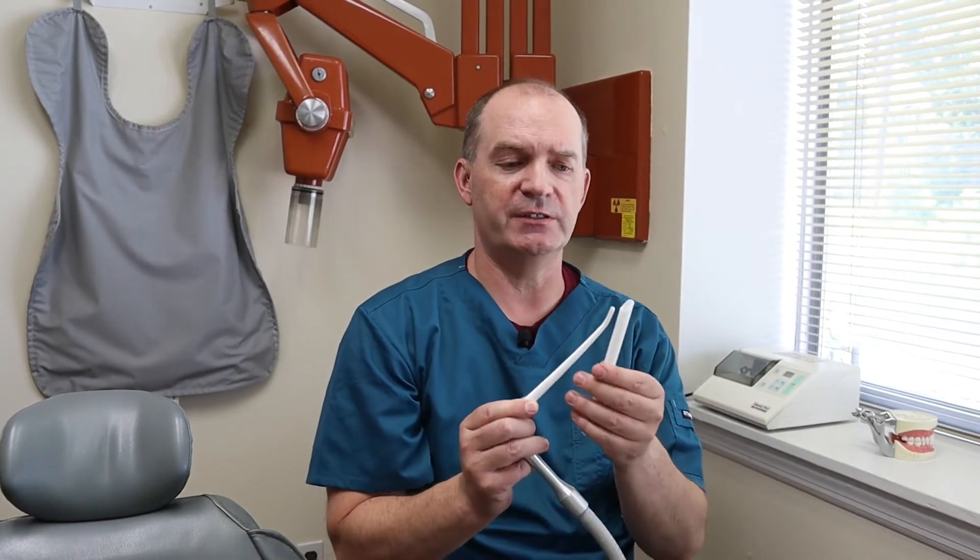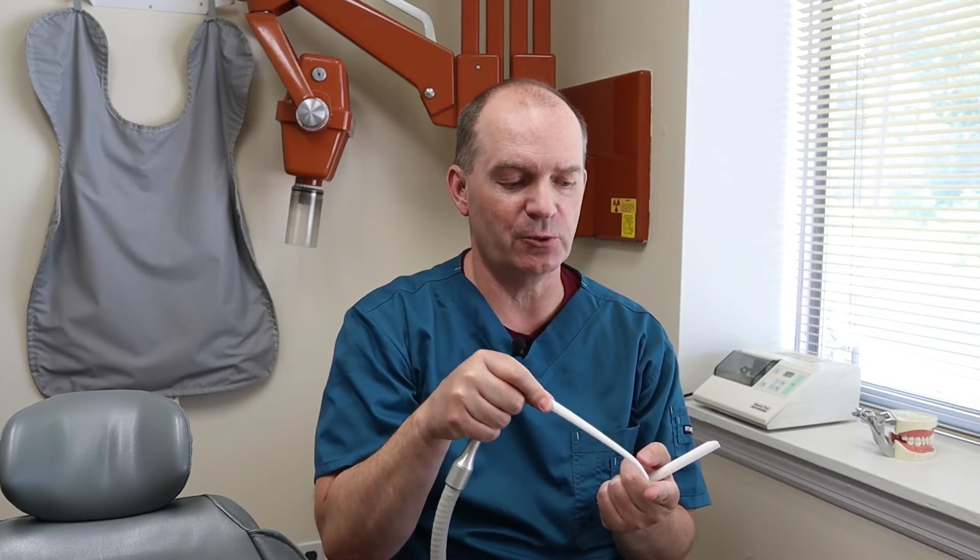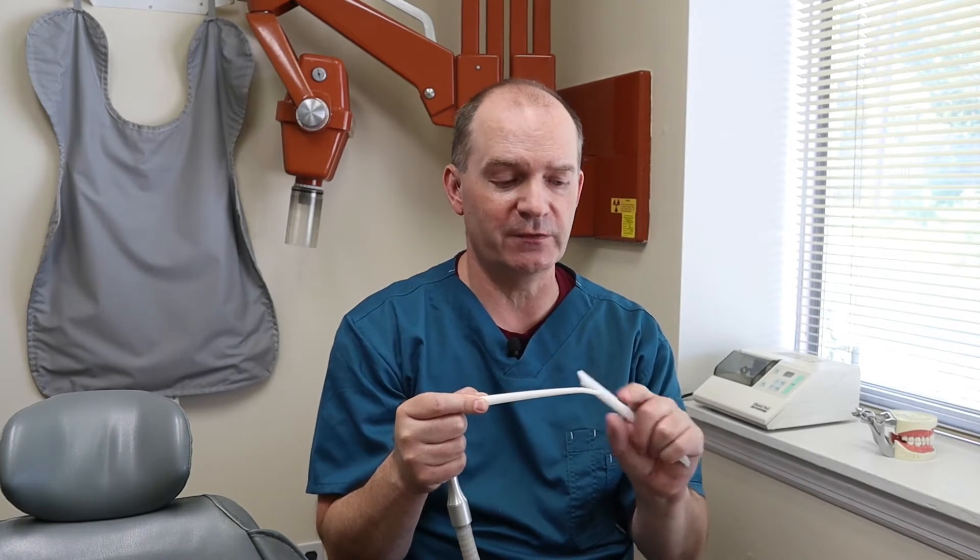The traditional high-speed suction also has a different tip called the surgical suction tip. As you can see, it's a much smaller tip. This is generally used when we need suction in a tiny area. I typically use this when I'm extracting a tooth — taking a tooth out — and you can get in there and vacuum up the spit and blood so you can see a little bit better. Also for root canals, when we're trying to vacuum out the inside of the tooth, this can actually go inside the tooth, and there's another little attachment that fits the end of it that makes it even smaller, so you can get way down into the root of the tooth where you're doing the root canal.